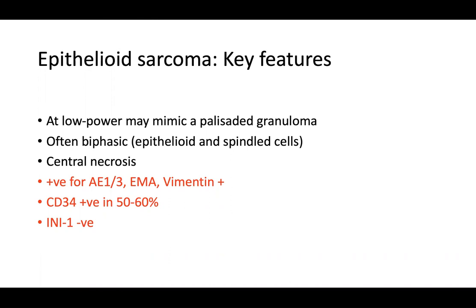The other thing is you're going to be able to observe that it's going to grow and you're going to have larger areas of necrosis. It's not going to be behaving like a normal palisaded granuloma type process like GA or even a rheumatoid nodule for that matter. But those are histiocytes in those entities.